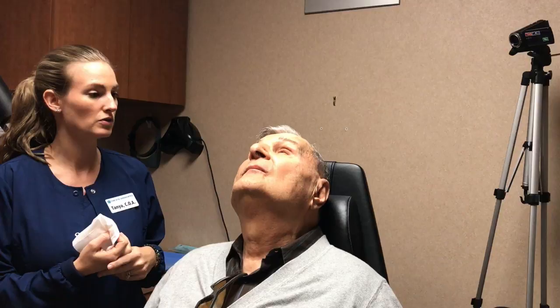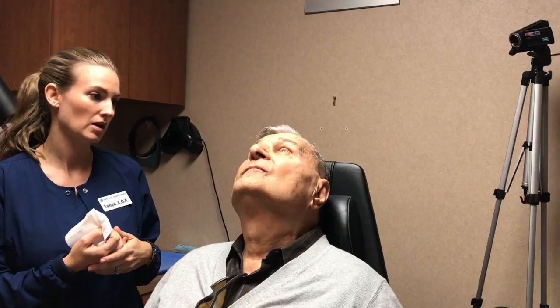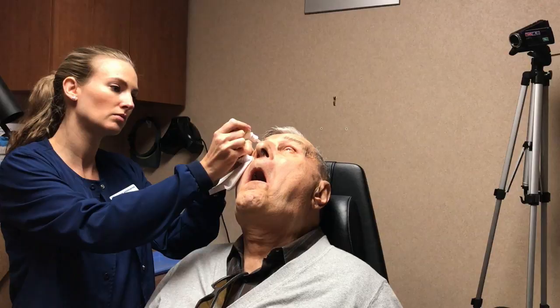I'm going to hand you a tissue here, and I have one for me. I'm going to go ahead and start your numbing process. You've been through this a few times, so you know we do three numbing drops over the next probably about ten minutes. So I'm going to start with your first one here — go ahead and look up for me.